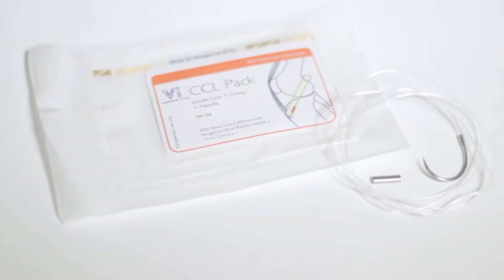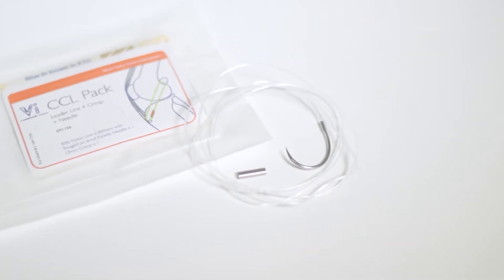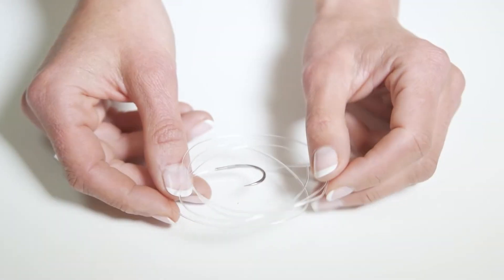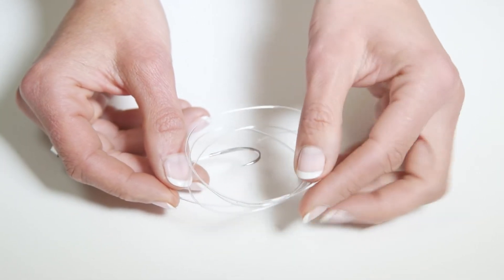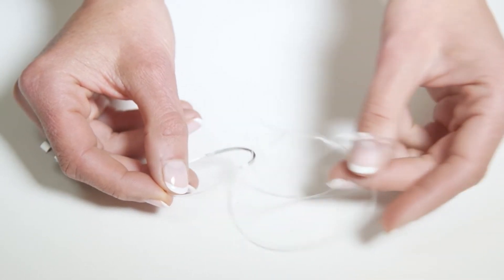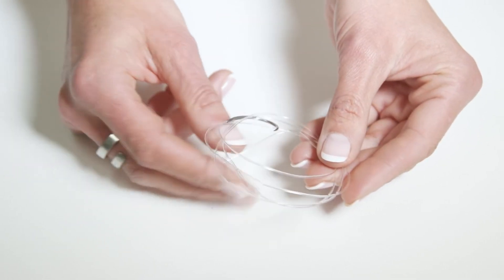Nylon is a monofilament line and has been the traditional choice for the lateral suture since the 1970s. It is still in very popular use, but it does have some disadvantages. It is not particularly easy to handle, having what we term good memory. This means it wants to spring back to its original position when handled, which can make it challenging to use. Knotting nylon can be difficult for the same reason, and a nylon knot can be bulky, which may cause irritation under the skin.